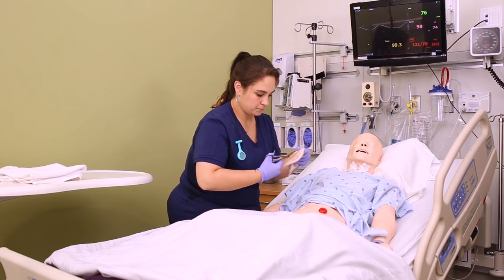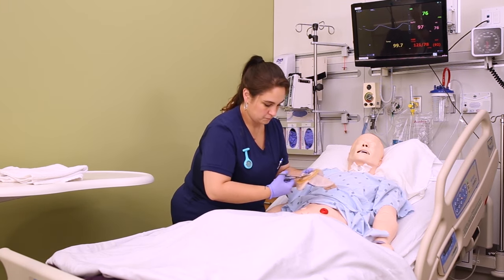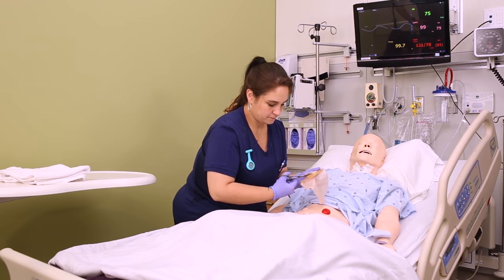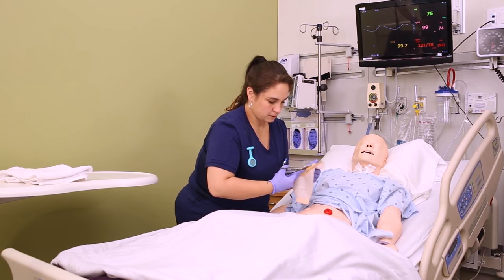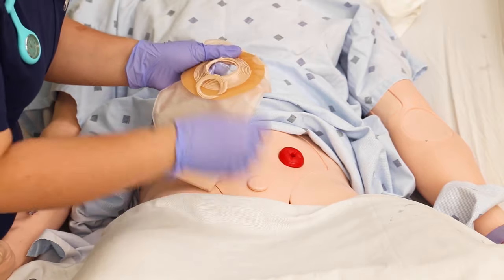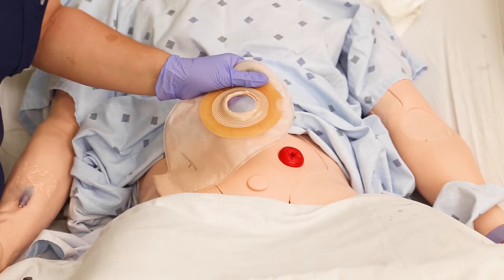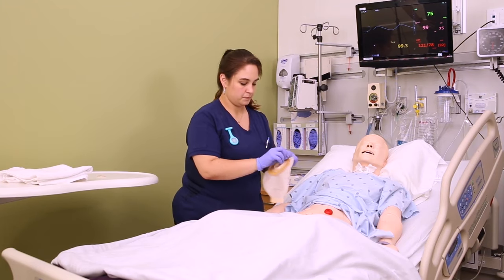Now you want to measure the stoma and cut the hole of the wafer to be about an eighth of an inch larger than the stoma. If it's too small it can actually cut off circulation to the stoma itself. Use a pair of scissors to cut around the inside hole of the wafer. Some wafers have little measurement tools and some don't, so just make sure you are about an eighth of an inch larger than the stoma.